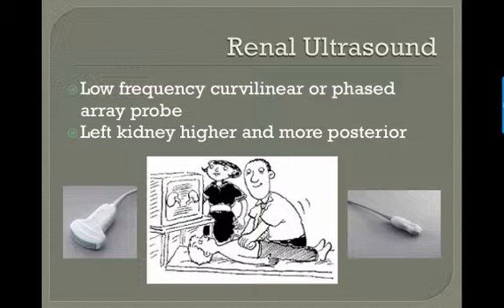So quick tips on renal ultrasound. You want to use your low-frequency curvilinear probe as seen on the left of the screen, or your phased array probe as seen on the right. The left kidney is higher and more posterior.